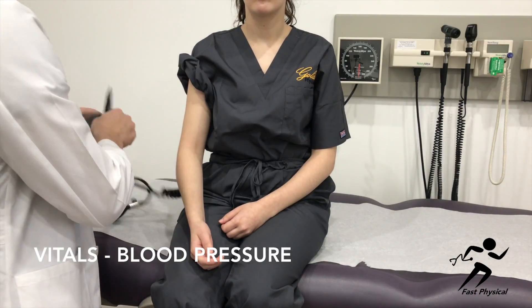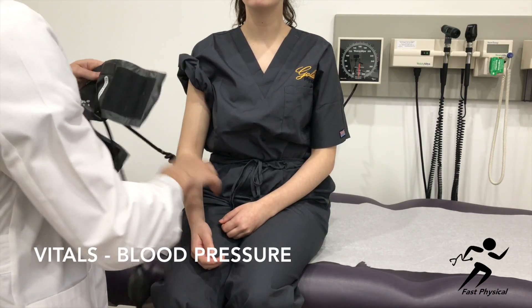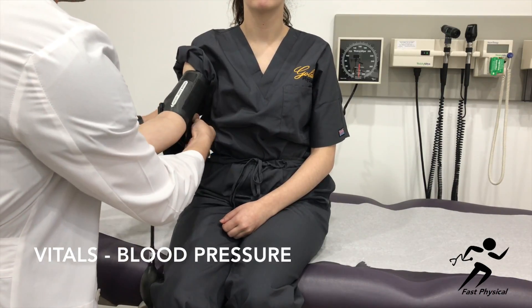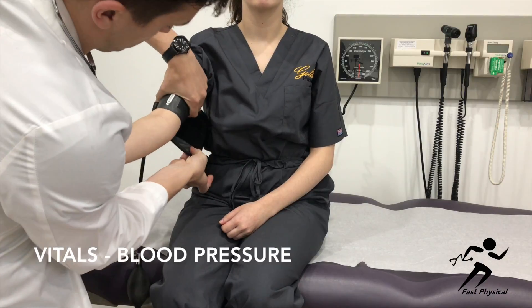Then select an appropriately sized blood pressure cuff. Notice the artery index marker — you want this to overlie the brachial artery that you just palpated. Secure the cuff.